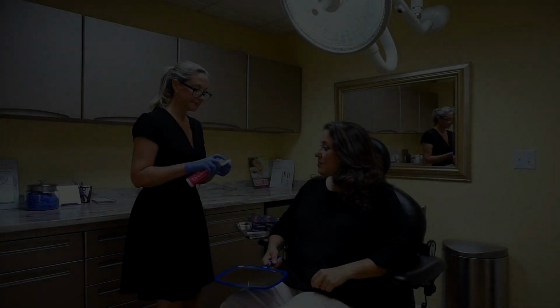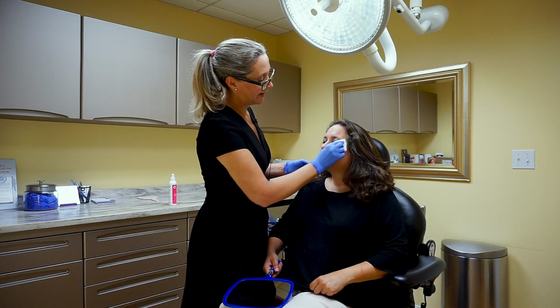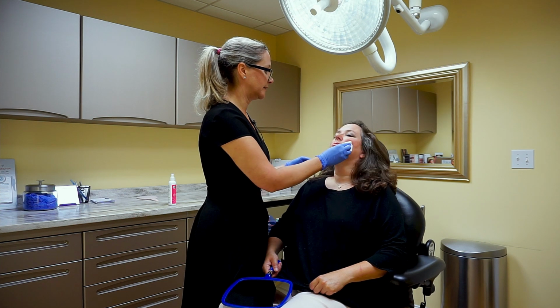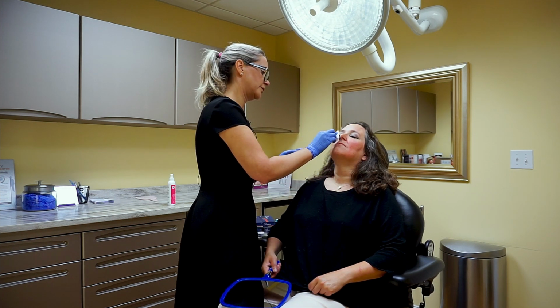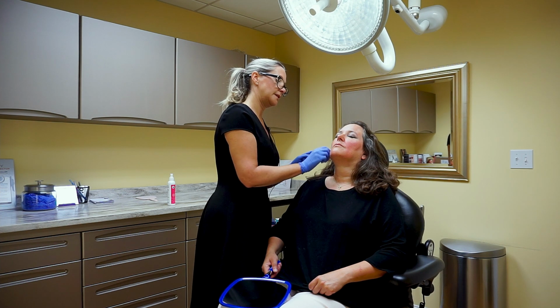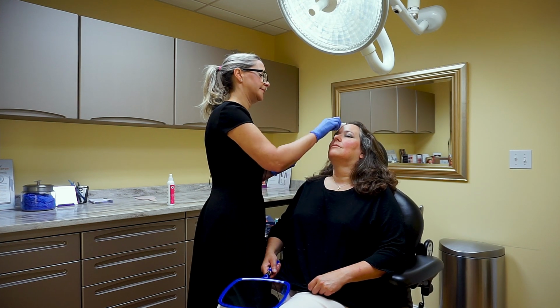So here we are with Jody, and she's getting some filler in her face today. Usually when I do filler, here, put your head so it's not bobbling. When I do filler consultations, the most important thing is to figure out what a patient wants with their face, not necessarily what I want. So what's bothering you? What do you want to achieve?